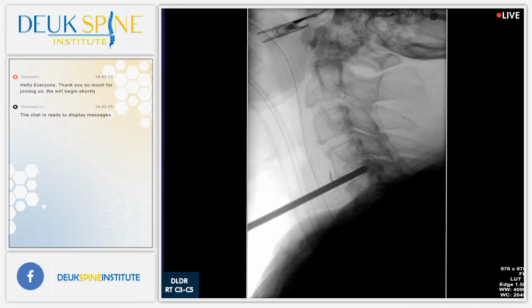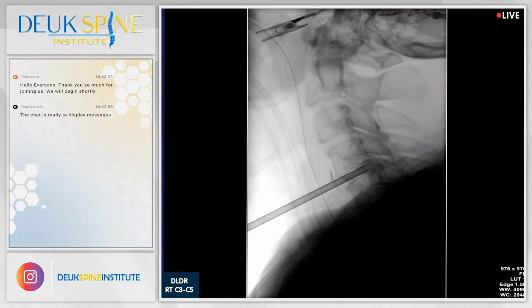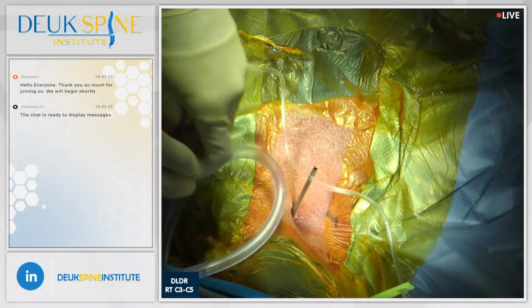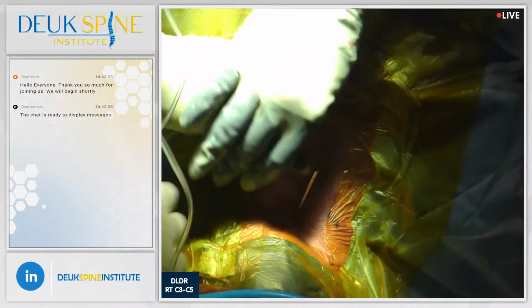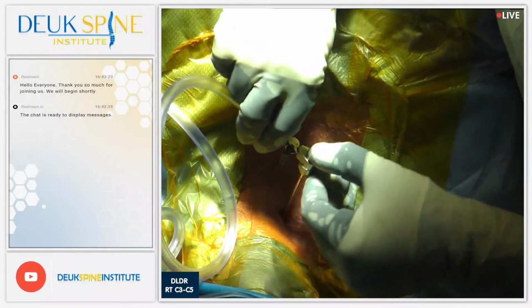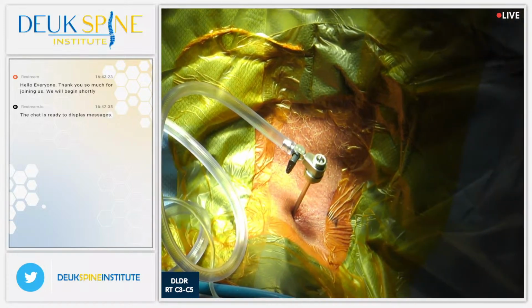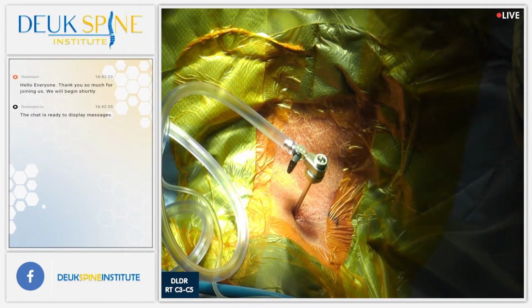I'm starting at his worst disc, number 4-5. Really hope this works for him. No, that's not the right thing. Here, let me help you. Any questions? At this moment, no current questions. All right, Henry, let's show the audience how the Deuk laser disc repair works. Copy that.